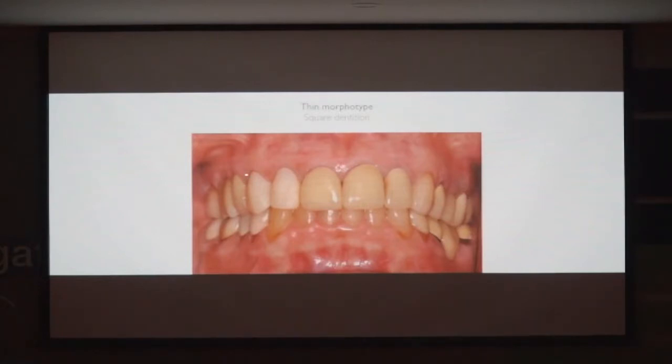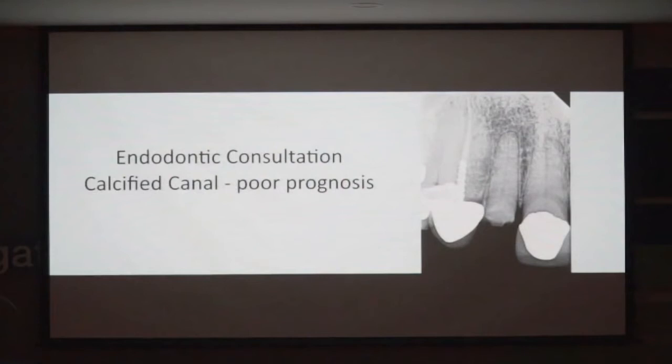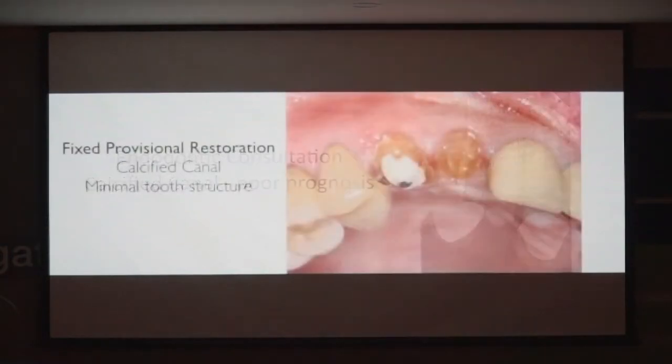So this is a cantilever off 7, a cantilever off a 6. Now, the endodontist doesn't use an X-Guide, so they said this tooth is hopeless. Well, I would tell you now that you could use the X-Guide to go through there, even though it's an off-label use. So there we are beforehand.